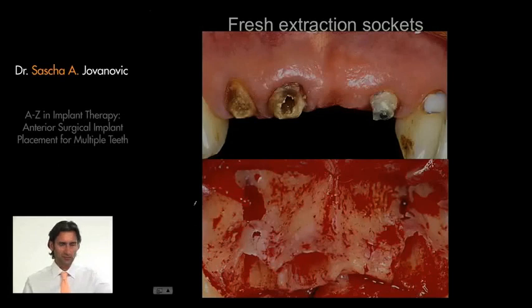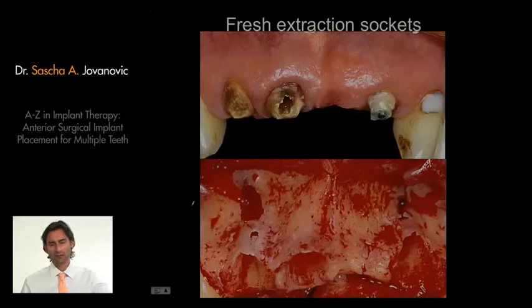Here's a patient who was elderly. She was past 60 years and had these 3 teeth still present, but with root canals and posts. After some fractures, a treatment plan came up to retreat this patient with a traditional 4-unit bridge. But the dentist saw that there was not enough root or tooth structure available to restore this, unless again going through root canals and posts. With these short roots, it was not a viable option, and implants came into discussion.